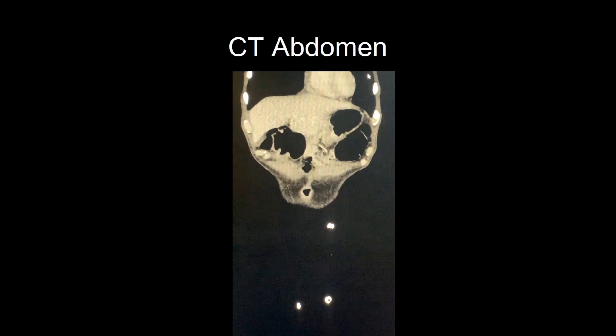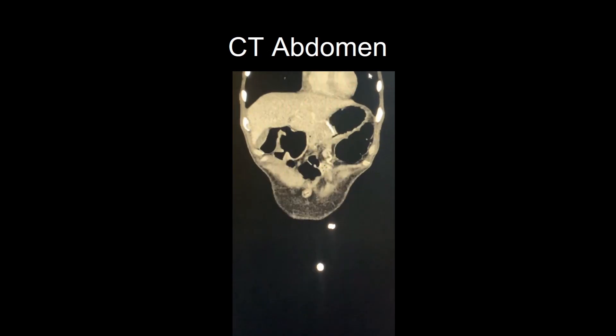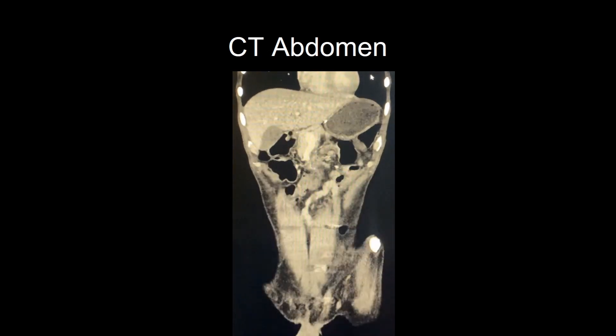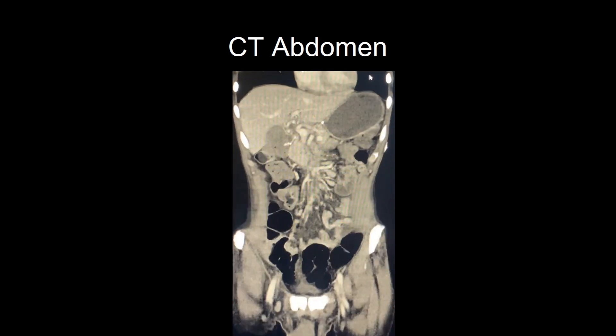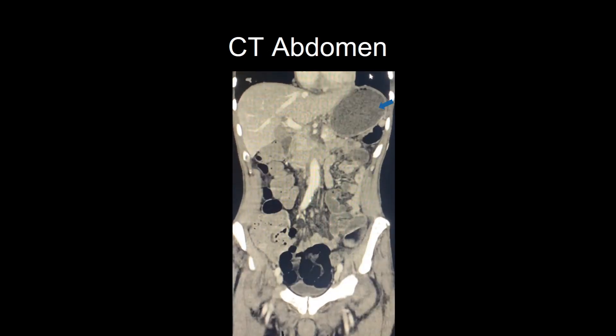CT abdomen and pelvis showed post-surgical changes of Roux-en-Y gastrojejunostomy. The proximal stomach was distended with an air-fluid level. In addition, wall thickening was seen at the GJ anastomosis, extending 2-3 cm distally in the jejunum.